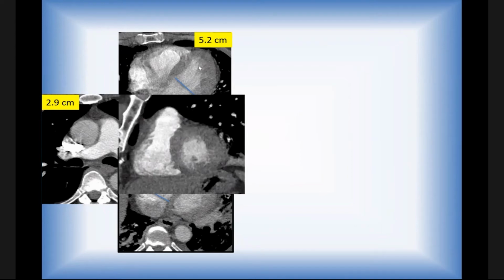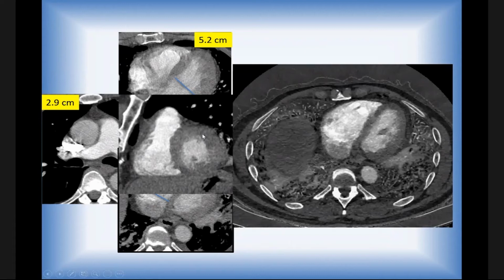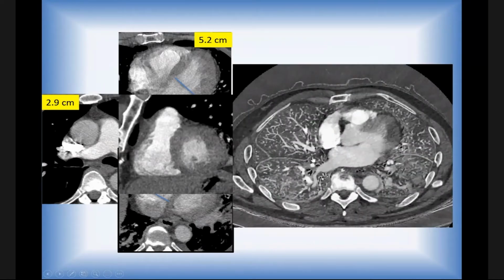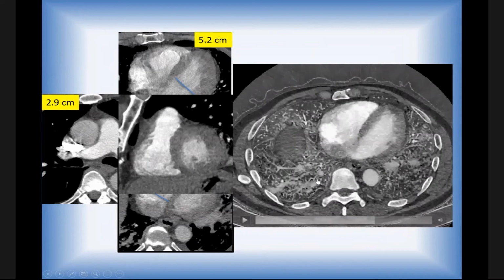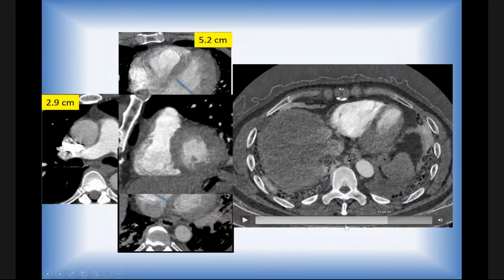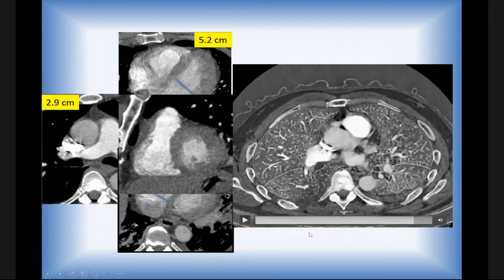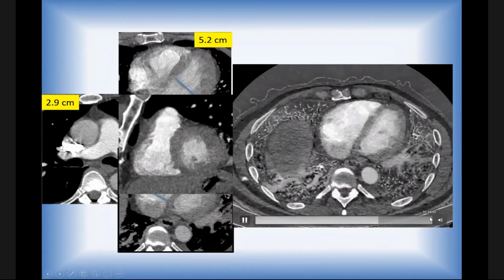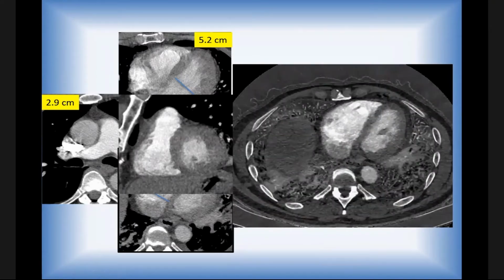We can see that the septum is not bulging toward the left ventricle, so there's no right heart strain here. And then this is the grayscale image of the pulmonary blood volume. So it can tell you where the blood in the pulmonary artery goes here. Okay, this is a grayscale. It's from a GE scanner, so the images are not so lovely.